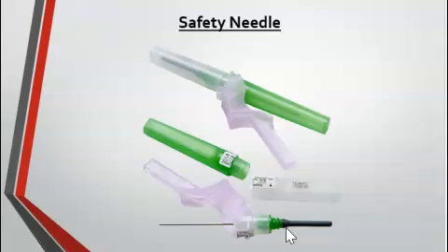This is the end that's going to go into the tube holder, or sometimes we just refer to it as the hub. And again, you can see that rubber sleeve on this side of the needle, and ultimately the blood tube is going to come up and be inserted onto that needle on this side.